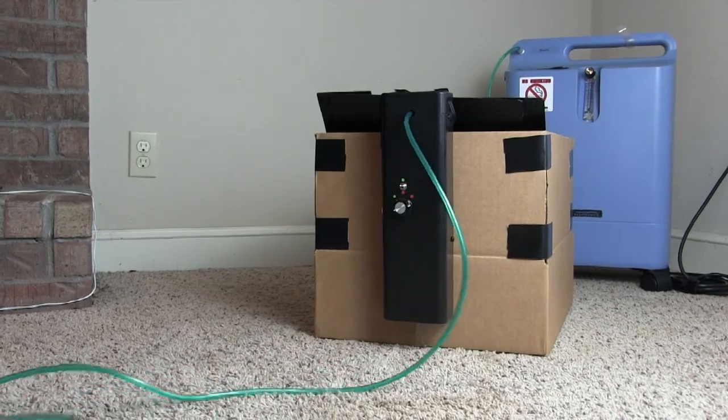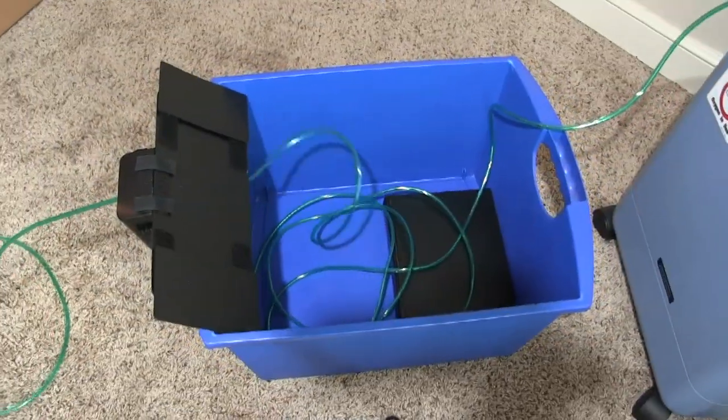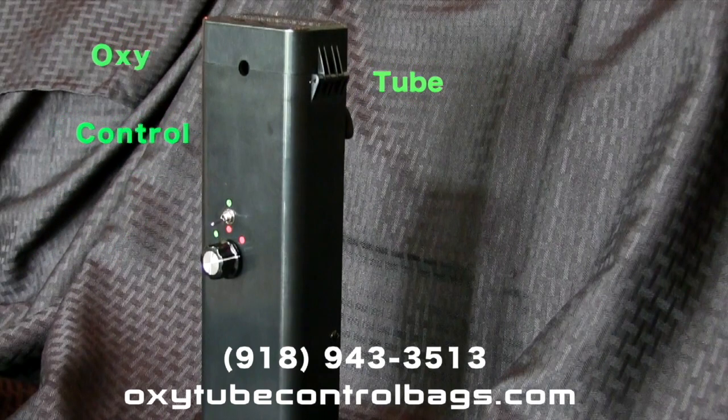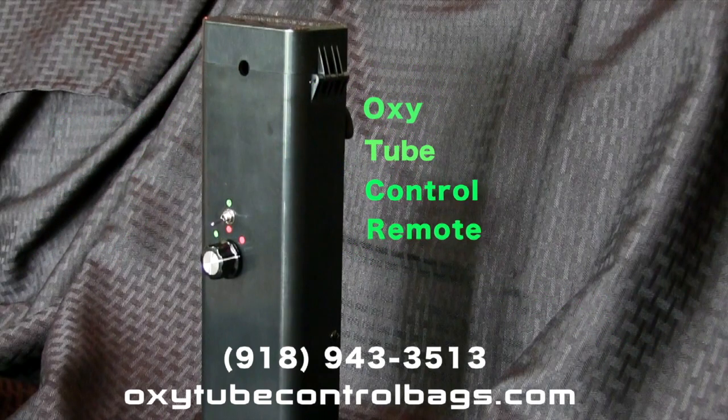And best of all, it's offered at a price nearly anyone can afford. For more details, call or visit our website today. The Oxytube Control Remote.